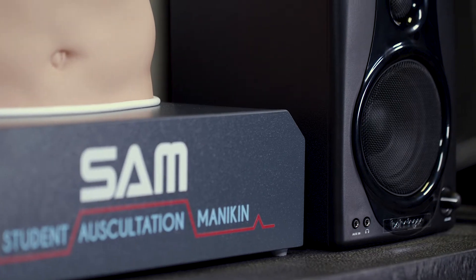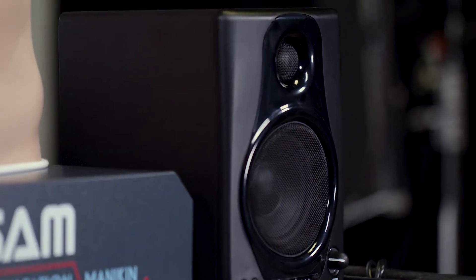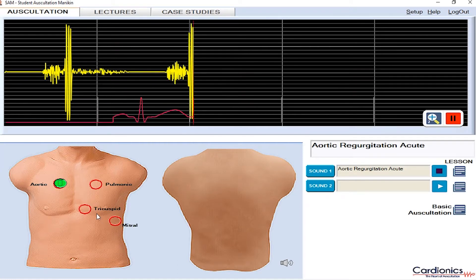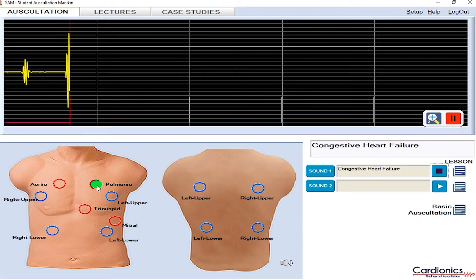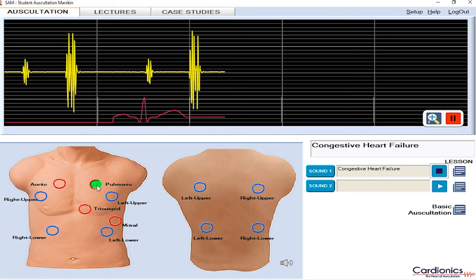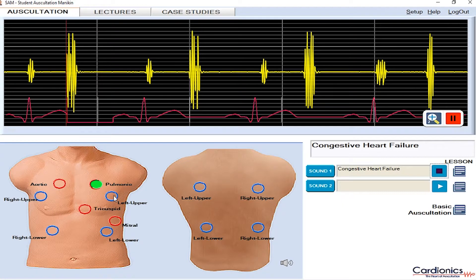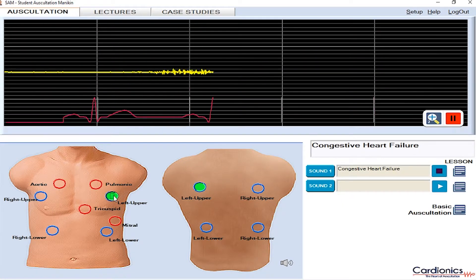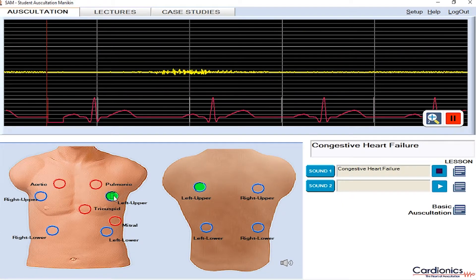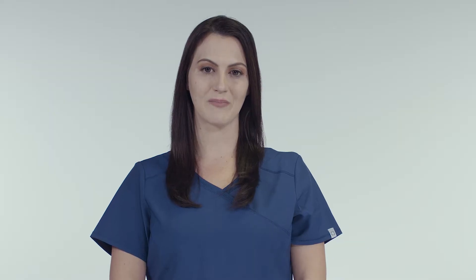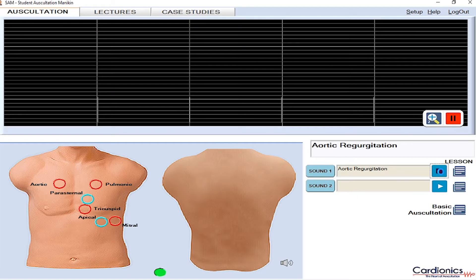If you would like to play the sound aloud with the optional speaker, or if you'd like to see the EKG waveform and echocardiogram, click one of the highlighted auscultation sites on the SAM diagram. For cardiac sounds, you will have four sites to choose from: aortic, pulmonic, tricuspid, and mitral. To view a live echocardiogram of select conditions, click either the parasternal or apical sites.